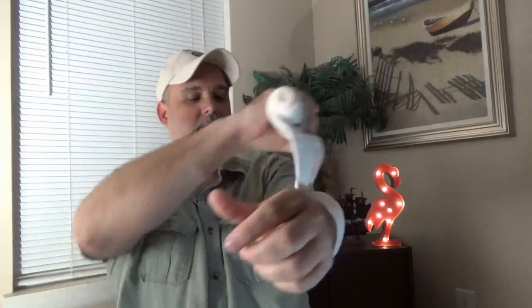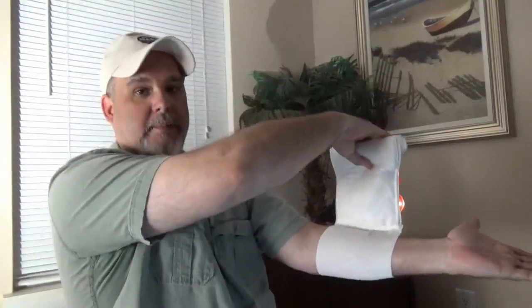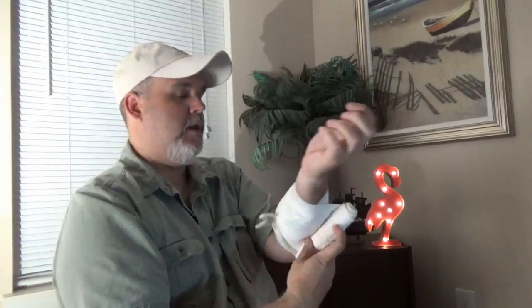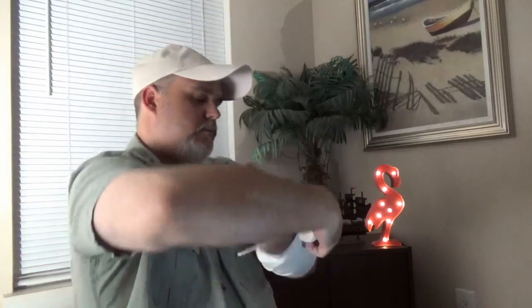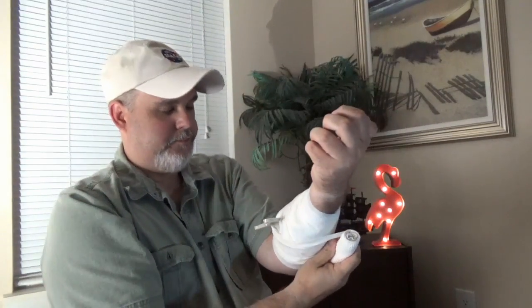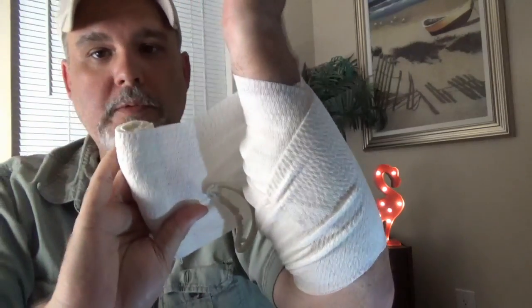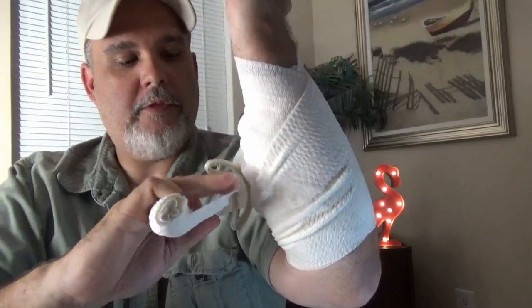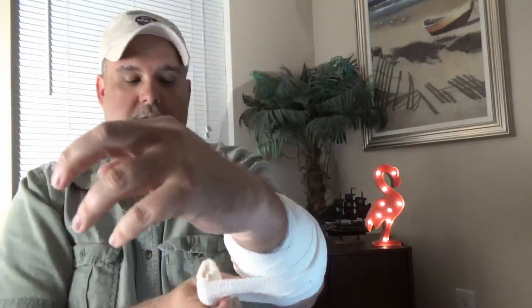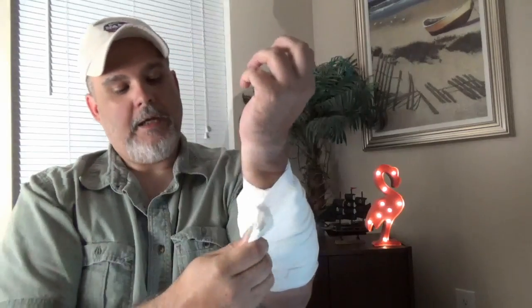Say you've got a wound on your arm — you put it on here, get it lined up, place the dressing part over the wound as best you can, and then start wrapping. Pull the bandage tight with each wrap, since it is stretchy. Once you've wrapped it, you can take the bandage and run it through that little hole, then pull it back on itself, adding just a little bit more pressure to the wound to help stop the bleeding.